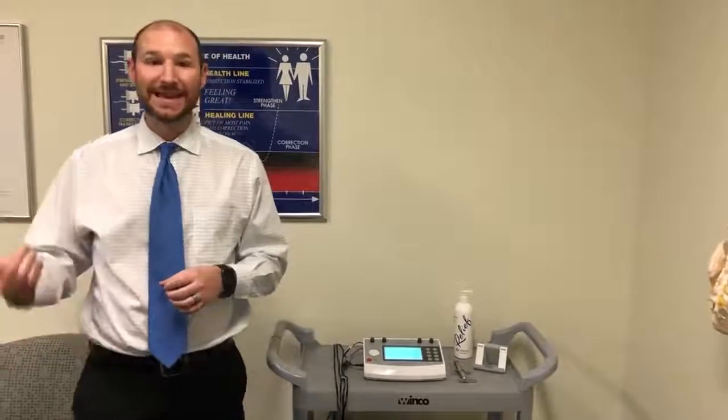Electric stimulation, e-stem, muscle stimulation — it's all the same thing. We use it here at Core Chiropractic as a tool for pain relief. We connect a couple of pads to your neck, lower back, or wherever you feel most of the pain, and we apply a small electrical charge. You'll start to feel some tingling in the muscles, and your muscles may twitch or contract. The goal is to relax the muscles and relieve pain, and it also gets blood flow into the tissues.